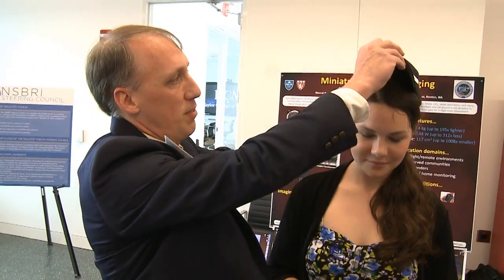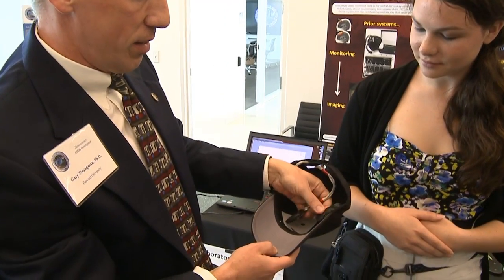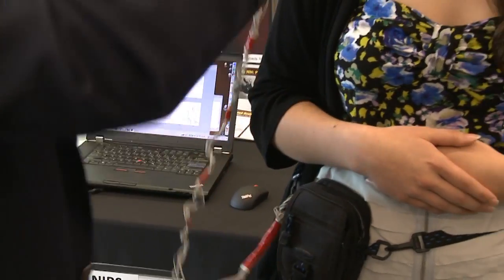Our model is wearing our device inside the cap — take the cap off. As you can see, the sensors are inside. We have an accelerometer in there, and we have the sensor itself. That can go on easily.